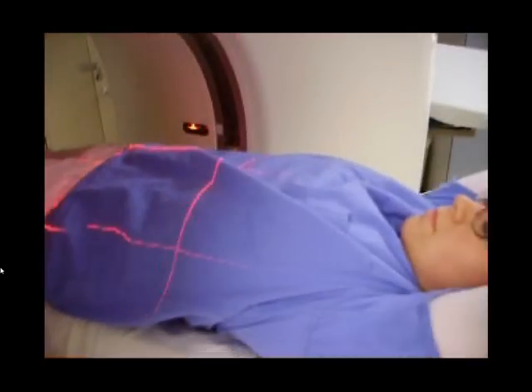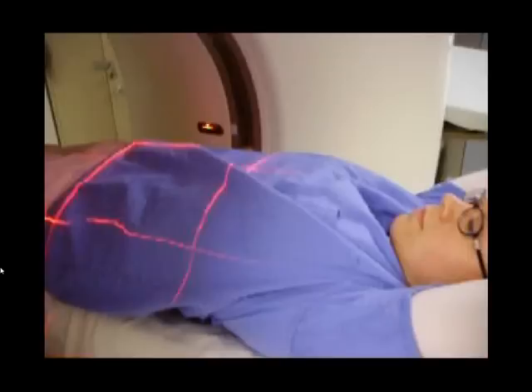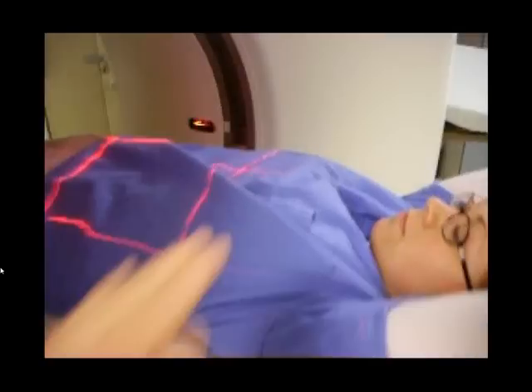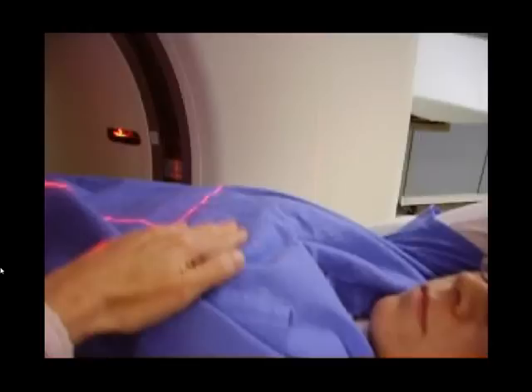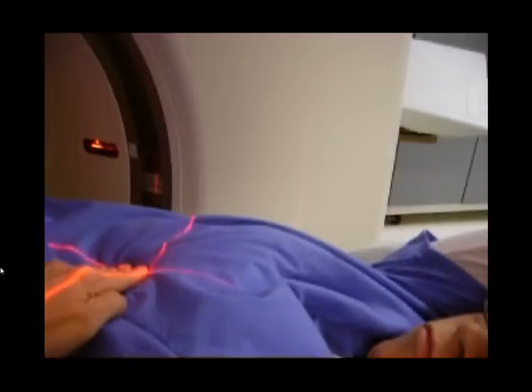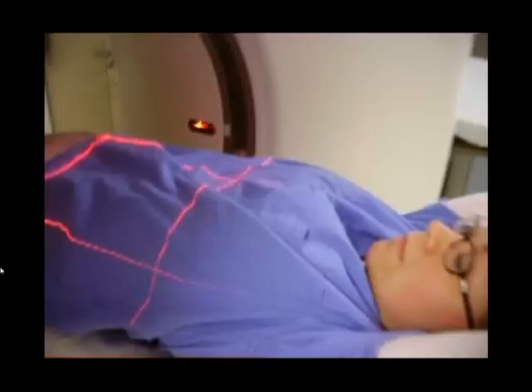Tell them every step of the way, I'm going to be moving the table, I'm going to be touching you, so that they're not surprised. And this is kind of a personal area to be touching people at anyway, especially for women. So you feel for that xiphoid tip, and that's right where the axial positioning line is going to go for an abdomen and pelvis CT.